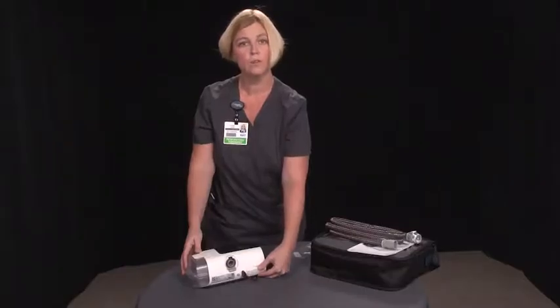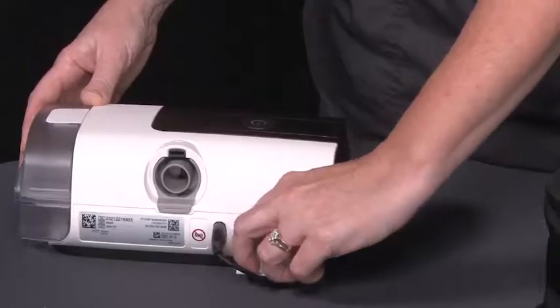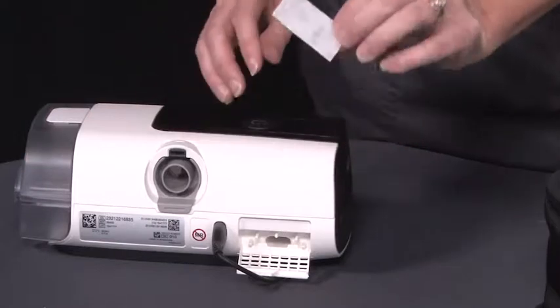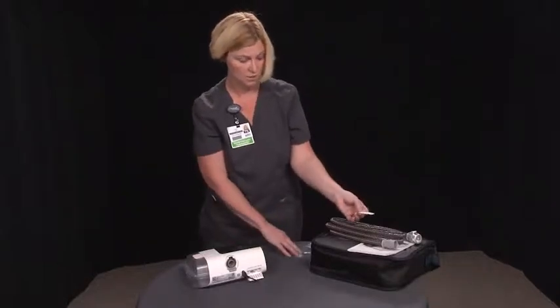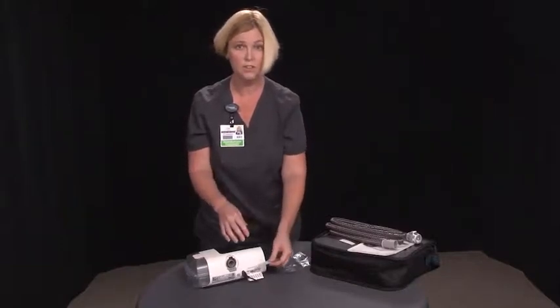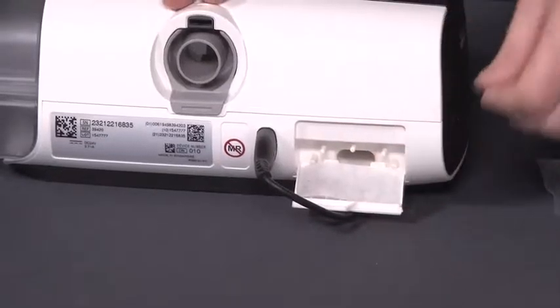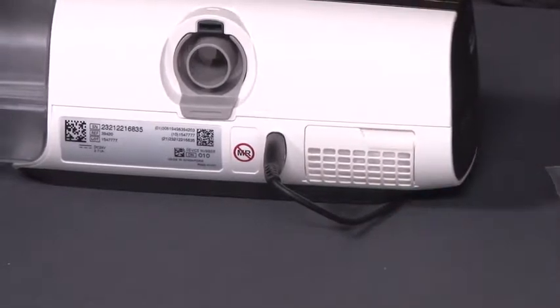So once every 4 to 6 weeks, or as needed, you're going to want to change this filter. To do that, you're going to pull it out of your unit, dust it off. It'll probably be gray or really dark in color. You'll throw this away. You'll get a new filter, and you'll want to place that new filter in your machine. These filters are included with your setup and will be put in your bag when you leave your appointment. The filter sits down in the filter inlet and snaps to close. So that is changing your filter. You're going to do that once a month.